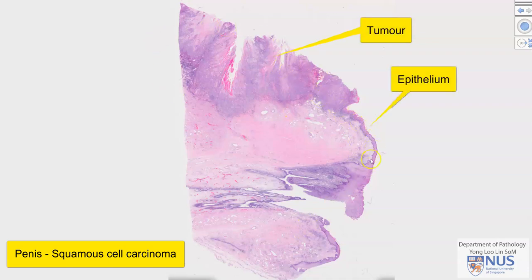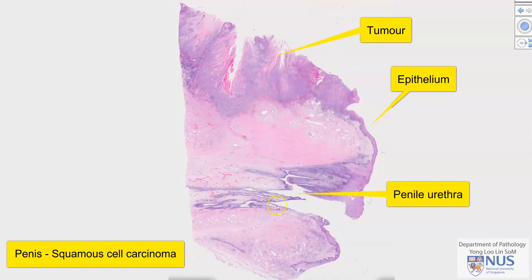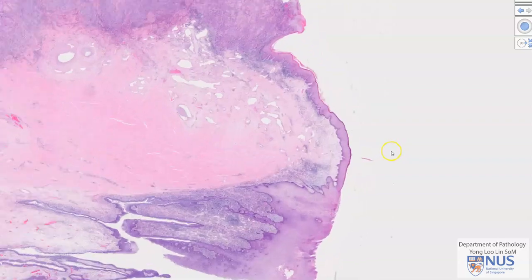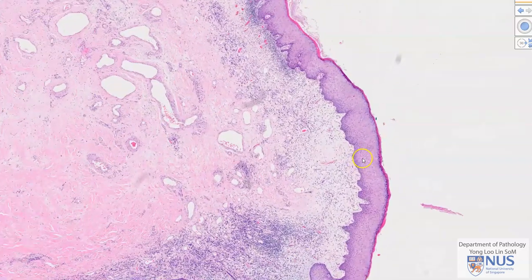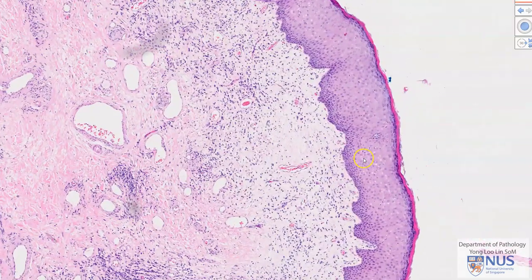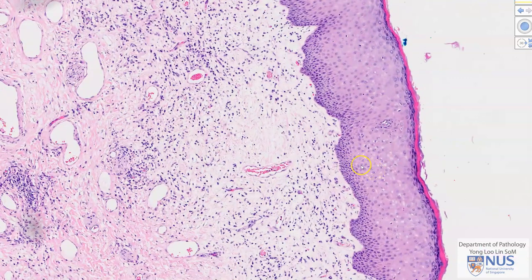This is the epithelium of the glans. Here is the penile urethra. Let's have a quick look at the normal epithelium of the penis. We can see that this is stratified squamous epithelium, and in this case there is a little bit of surface keratinization, which may or may not be present.